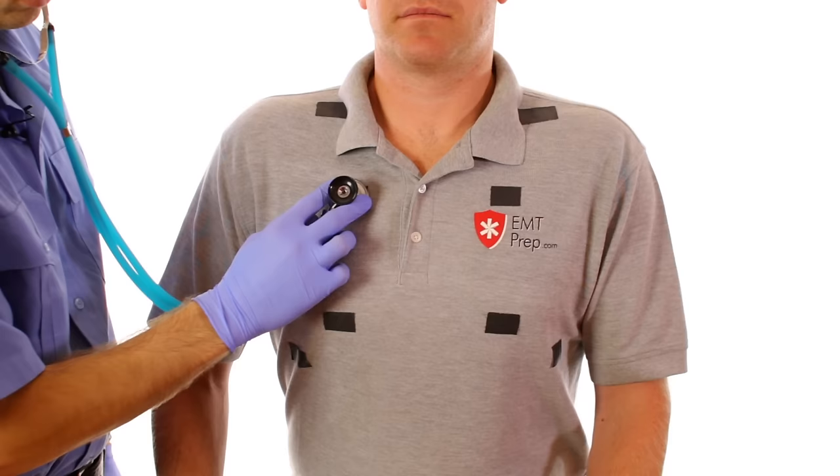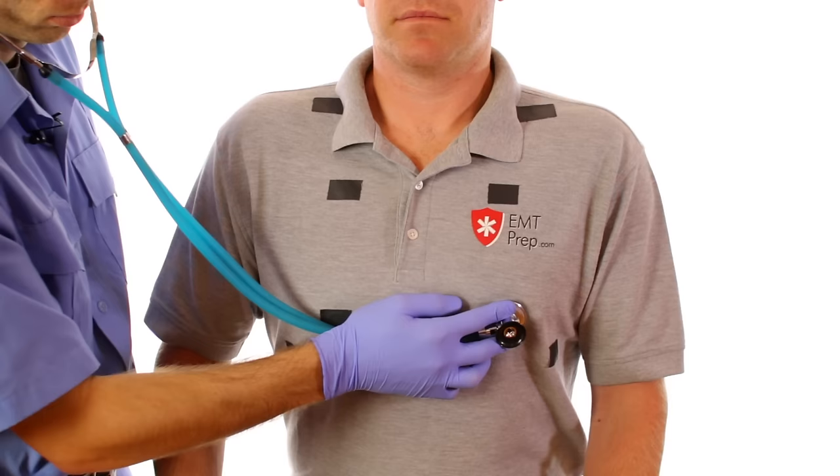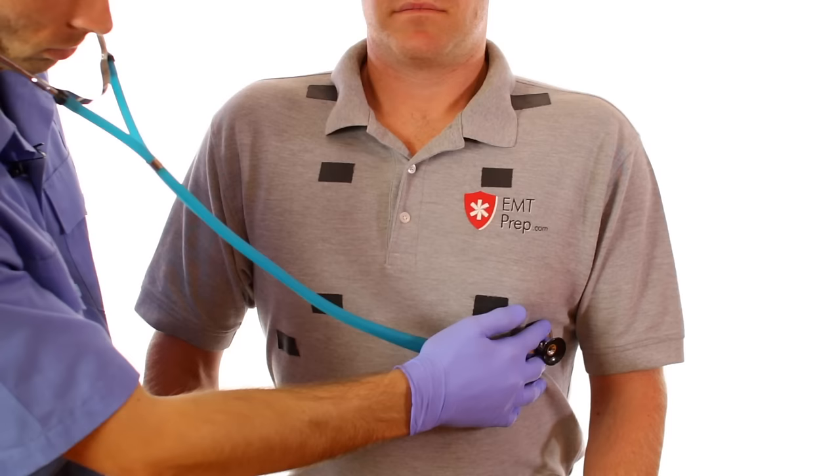Start just above the clavicle to measure the apex of each lung. Move down to the upper lobes, then to the middle lobe of the right lung and the upper lobe of the left lung. Finish by auscultating the lower lobes of each lung.